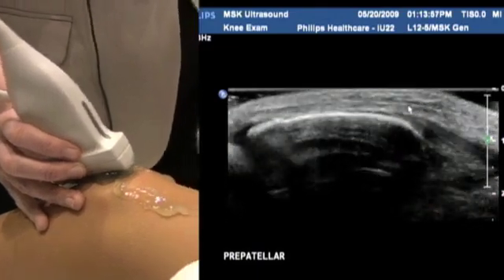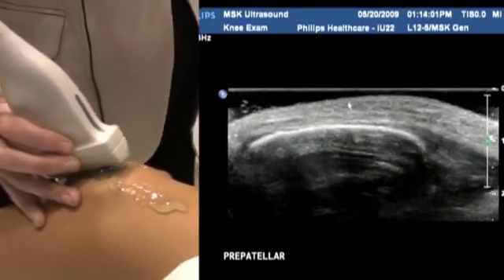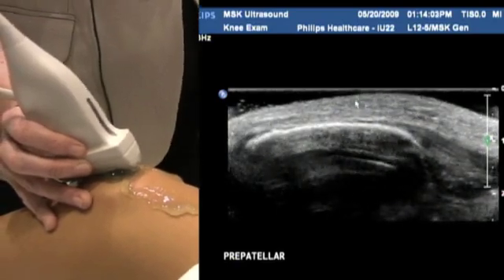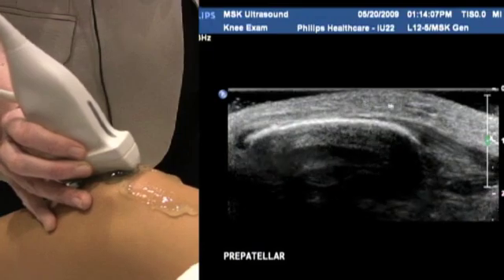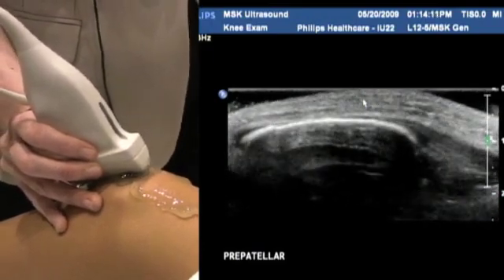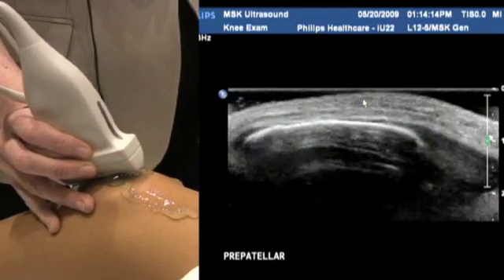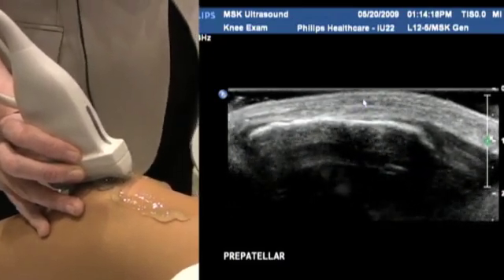And if you push too hard, you can completely compress it. So you can just imagine if there was a line of fluid just sitting above the patella tendon here, above the mid portion of the patella, that's where you're going to find the bursa. And again, it is indistinguishable unless you have fluid in there. But again, make sure that you're not pressing too hard and obliterating the bursa completely.